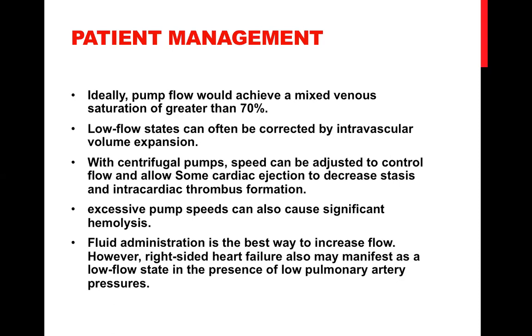So I'm not really sure we're going to utilize it. It's going to be for a short period of time. It's going to be for improving the ventricle and unloading the ventricle while you're having ECMO. But ECMO is going to remain. Mm. Okay.